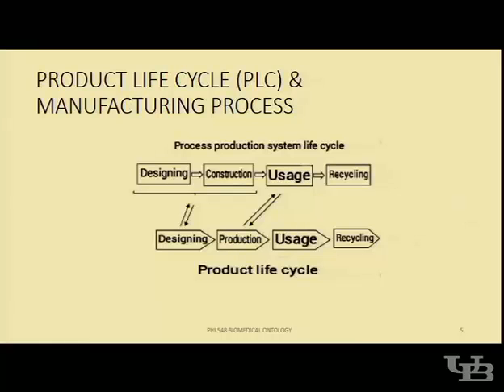As we talk about the manufacturing process for this application, it is closely related to the product life cycle, where it will involve designing, then construction, the usage, and then recycling, where the usage is the information link between the phases.